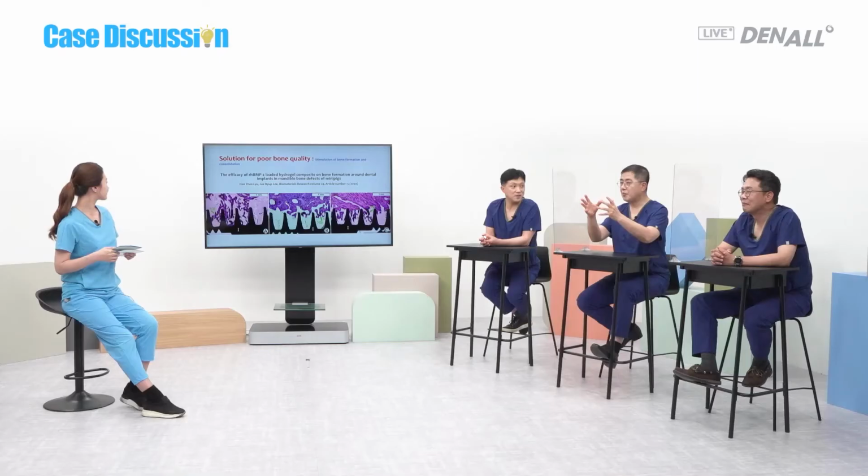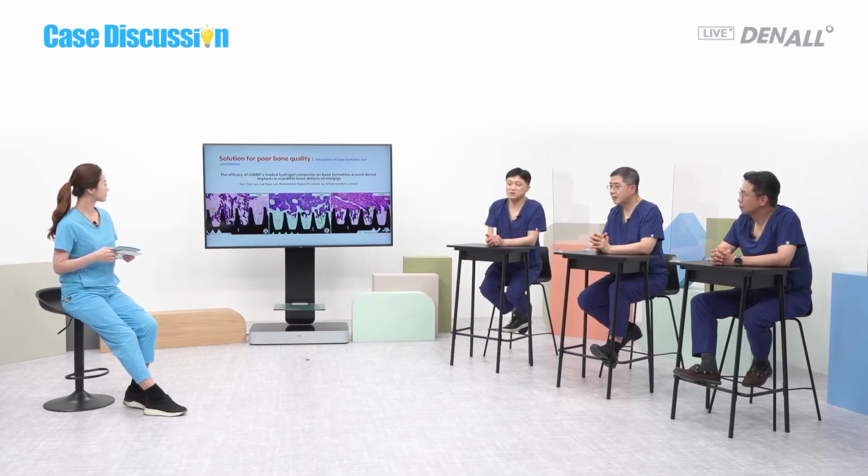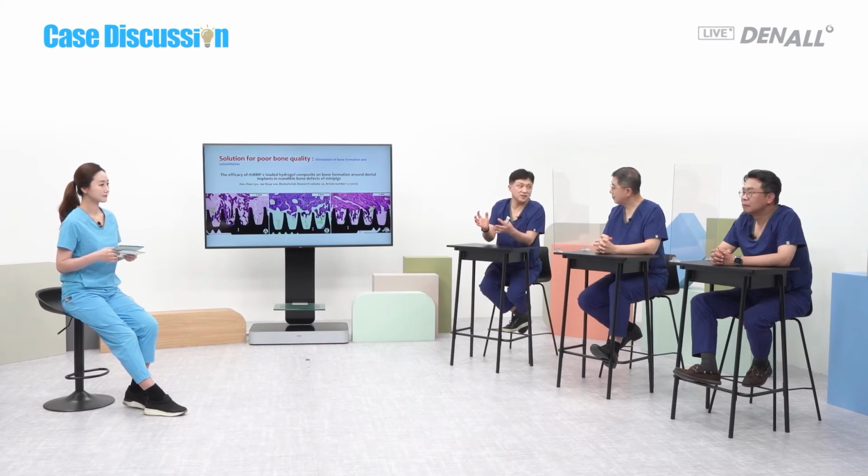Do you insert this after the bone is prepared? Do you insert BMP before you place the implant? Defect is created intentionally. Initial stability will be gained from the bottom, and on the crestal part, the implant does not come in contact with the bone.